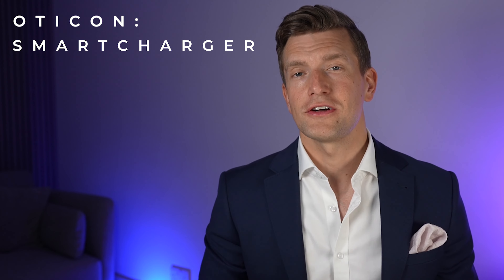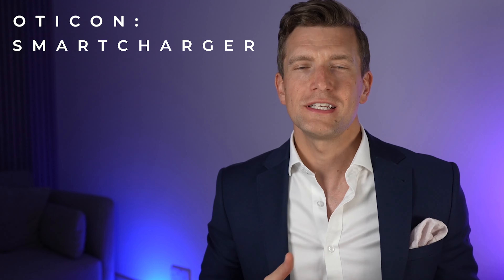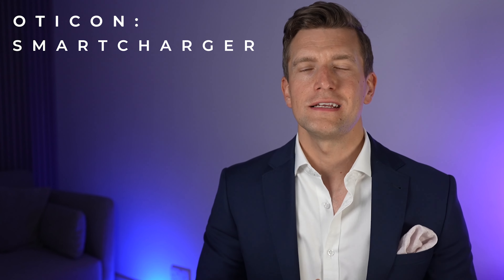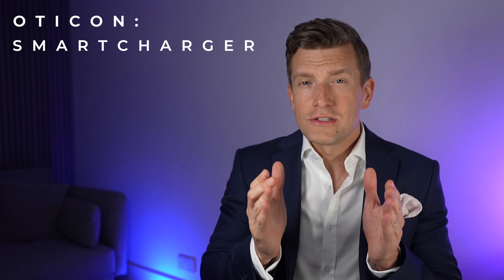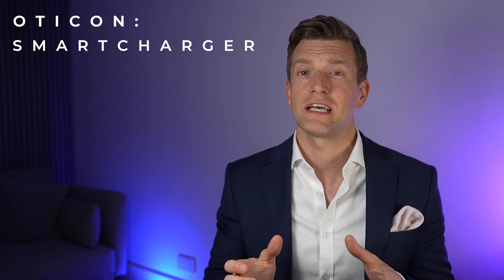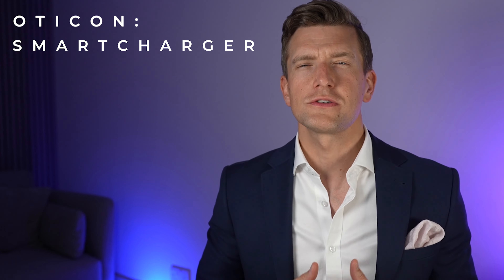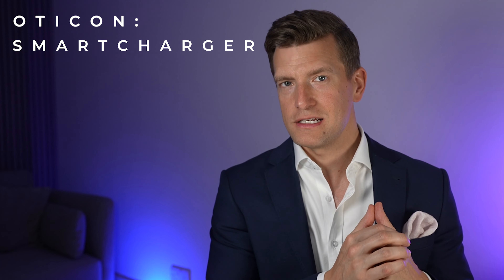The last feature I'm a fan of with the Smart Charger is actually a byproduct of it being an inductive charger. This type of charging produces a very small amount of heat, and with the lid closed, this heat is trapped within the charging case. So each time the hearing aids are on charge, this dries up any moisture buildup that may have accumulated during the day. Oticon state that as a result, this should ensure a greater amount of longevity with their hearing aids.